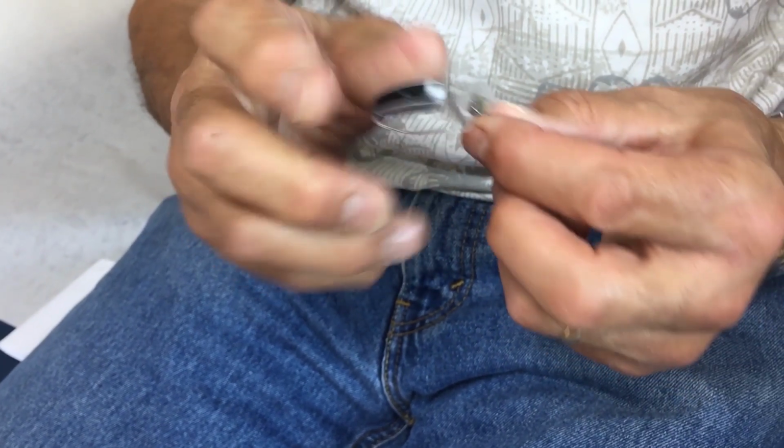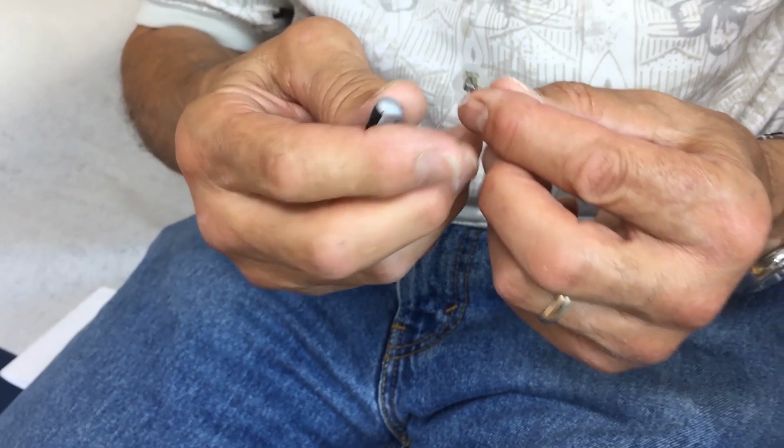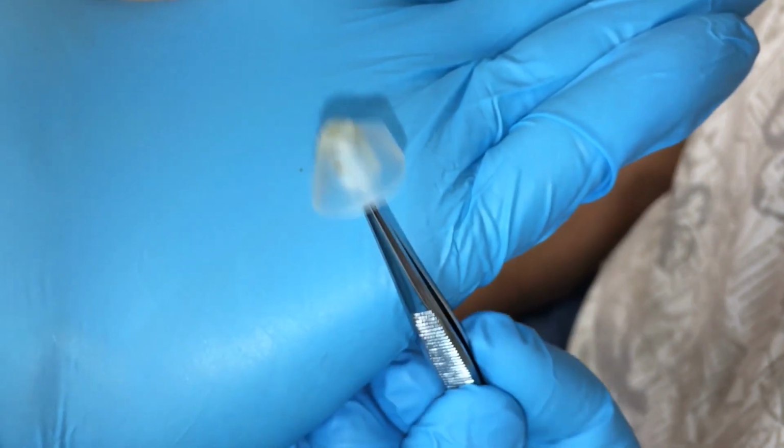You have something in your ear. What happened? Well, I wear hearing aids, and every evening I take them out to go to bed. When I pulled my left hearing aid off, it's called a tulip that's on the end of it. The hearing aid did not come out of my ear. It's detached from the hearing aid itself, and the tulip is right there inside of your ear. This is not the first time this has happened either.